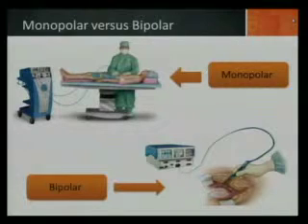And there are a lot of new technologies now that allow you to use the cut waveform, which is, like we said, the lower voltage, in a bipolar instrument, and have more of a clean cutting type of effect, and not just the increased coagulation.